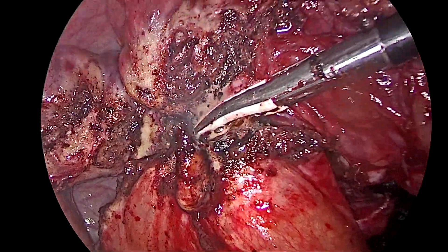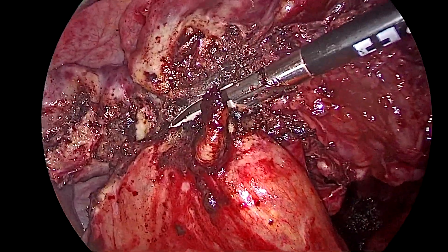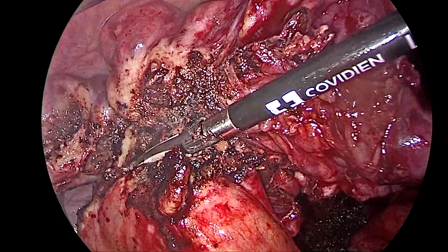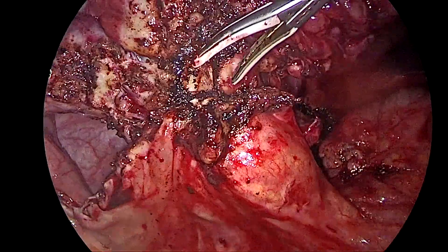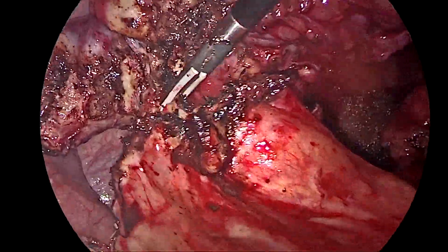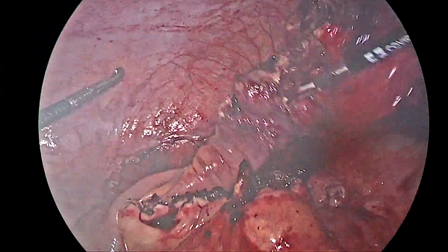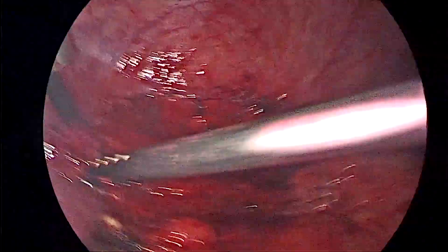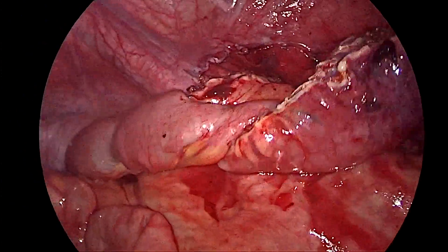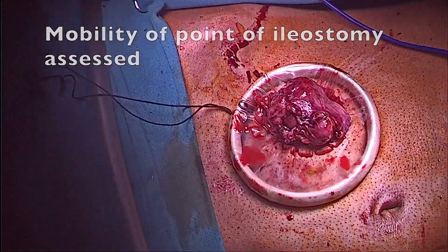Once divided, we will remove the specimen through a small trephine hole in the abdominal wall at the stoma site. We first confirm everything is divided, check hemostasis, and then bring the specimen out from the same site where we plan to do the ileostomy. Once division is complete, we check mobility — because sometimes in tuberculosis the mesentery is shortened — and confirm there is no twist, since in an end ileostomy a twist can occur.